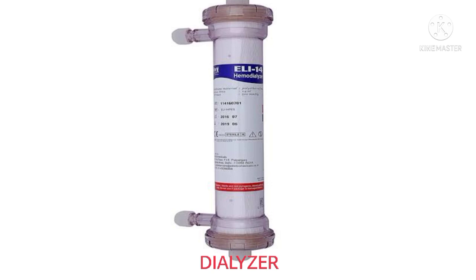Hemodialysis schedule. Hemodialysis for end-stage renal disease must be continued intermittently for the client's lifetime unless successful kidney transplantation is performed. A typical schedule is 3 to 4 hours of treatment, 3 days per week. The schedule varies with the size of the client, the type of dialyzer used, the rate of blood flow, and other factors.